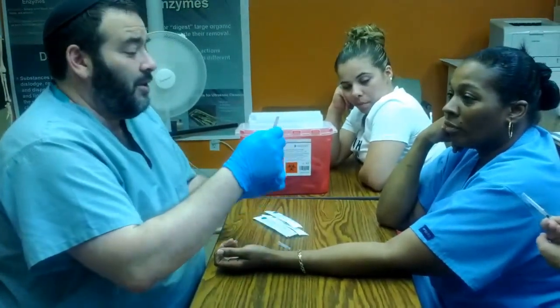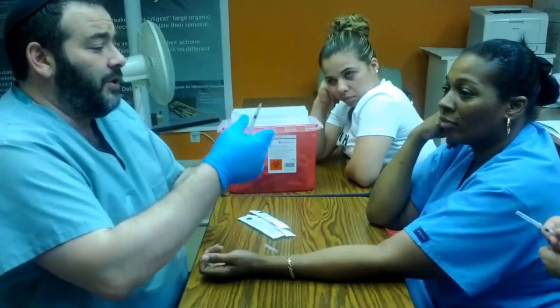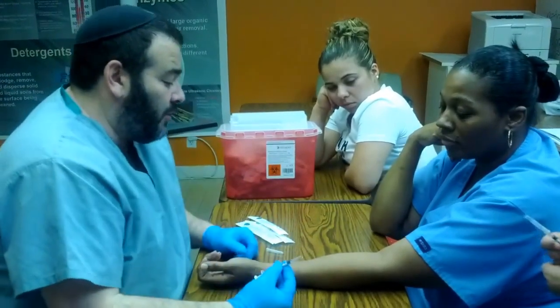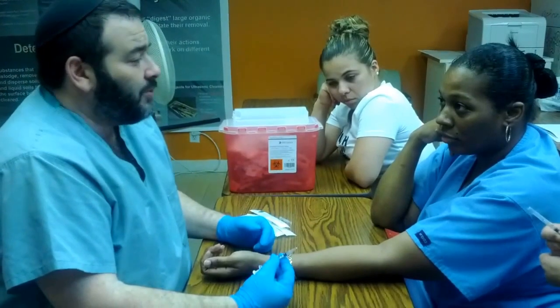If you can see this needle at all, you can see that it's tiny. Can't possibly hurt anyone. Okay, now grab your syringe just like so with these 3 fingers, somewhere halfway down the barrel. Okay, now we wait for the alcohol to dry. We can see that the alcohol has dried.